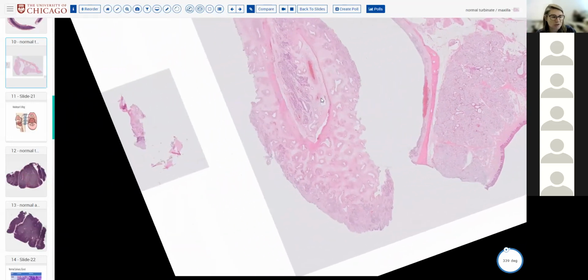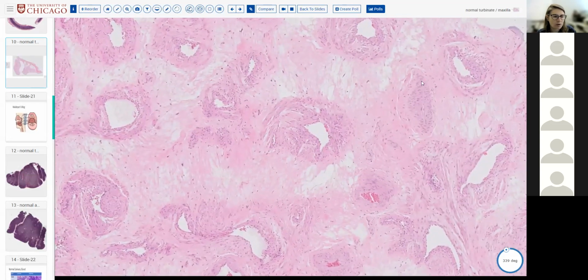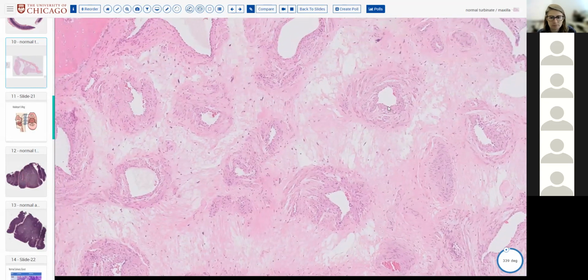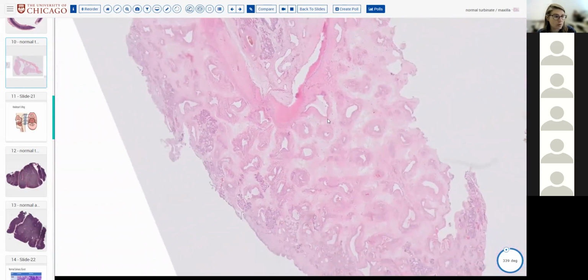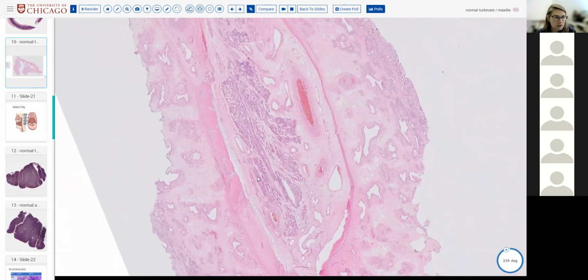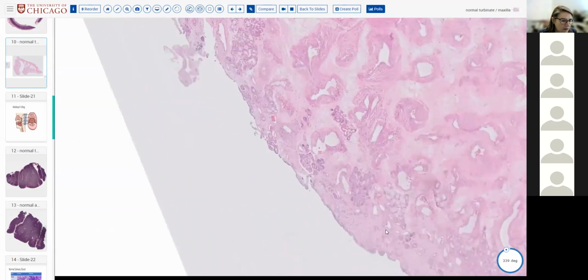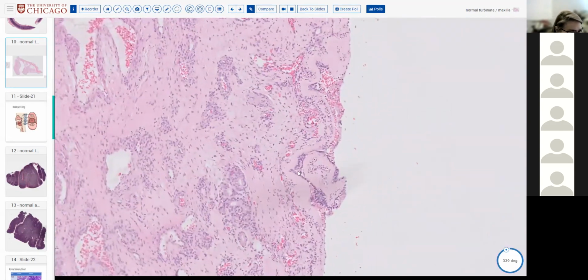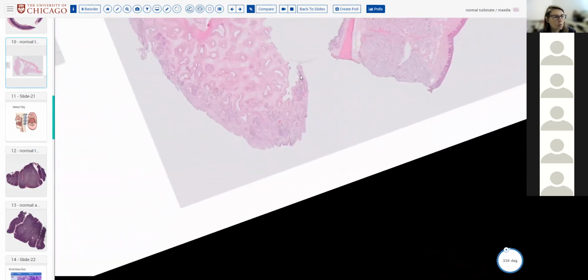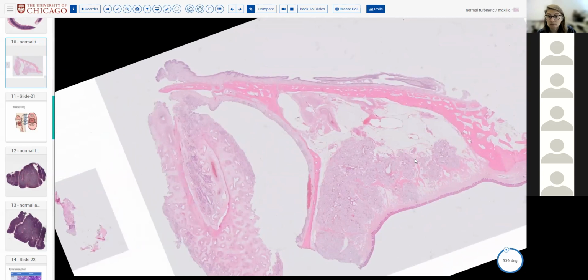Then this structure on the left, which can anybody note? What about this structure is remarkable? Very thick-walled vessels, right? So very thick-walled muscular vessels with a core of bone and a lining that's kind of denuded. Trust me when I tell you it's probably respiratory. Does anybody know what site we're in? Like the nasal concha? Exactly. So we're in the nose.